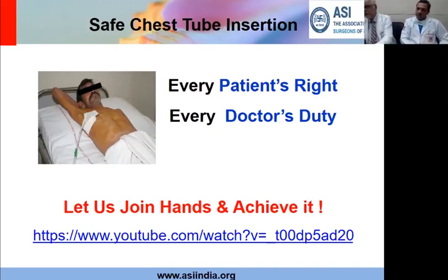Another point, when you mentioned removal, would you like to have a pre-placed U-stitch already placed at the time of insertion of the tube, or would you like to take it afresh when you are pulling it out? Some people put in a prefixed stitch. Our practice is that the purse string that we take at the time of insertion, we tie one knot and then wrap the two ends around the tube and leave it there under the plaster. At the time of removal, we just untwist the two loose ends and our one knot is already there.